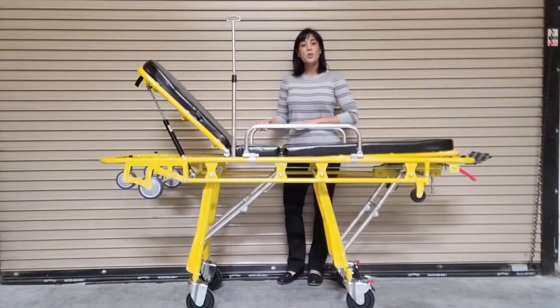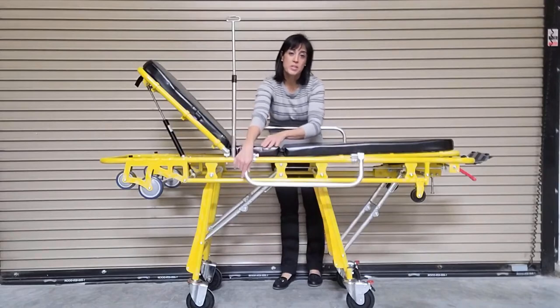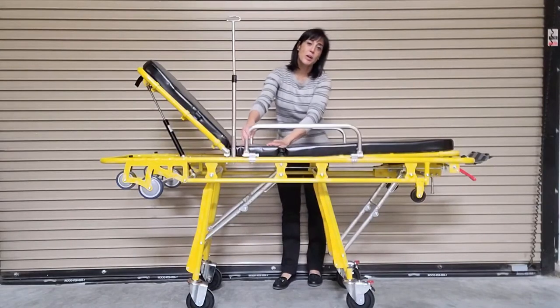The side rails on this unit also collapse, making it easier to load and unload your passenger. To collapse the side rail, simply pull the lever on the side and lower. To raise it, just pull up until it locks into place.